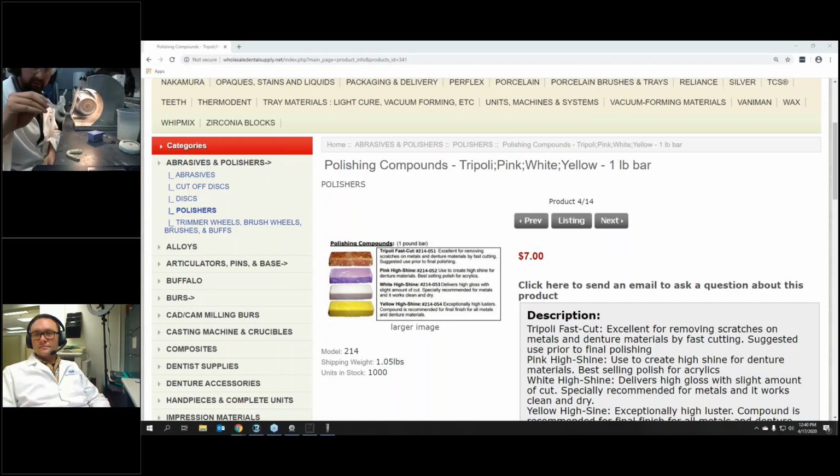And so, I didn't really spend that much time at it at all. And you can start to see, it's kind of hard to see in that webcam, the transparency of it. Now, the intaglio surface there, you can see that, but that's because you can't polish that surface. So I'm going to go ahead and continue to hit it with this lathe. And then what I like to do afterwards is hit it with just a super soft rag wheel, no polishing compound whatsoever. And it really gives a high shine. I'm going to change this wheel out real quick.